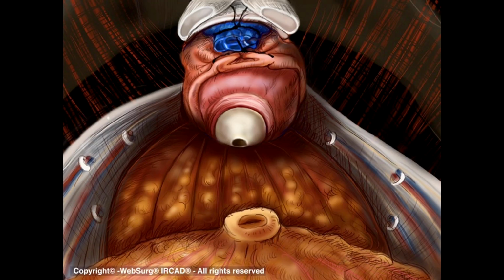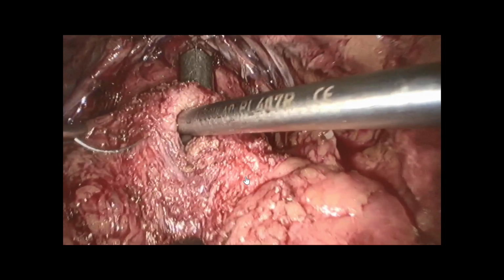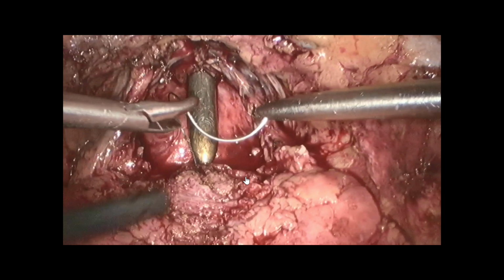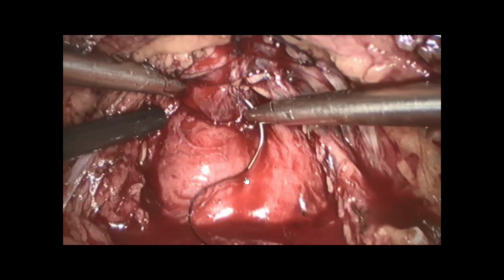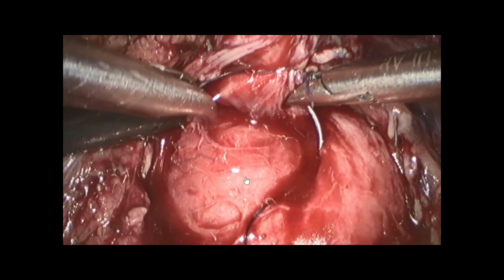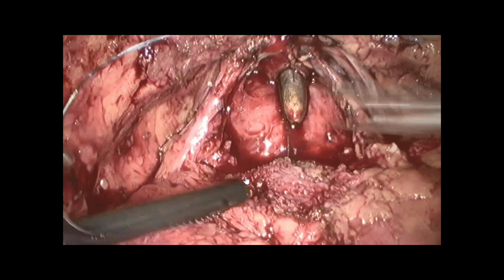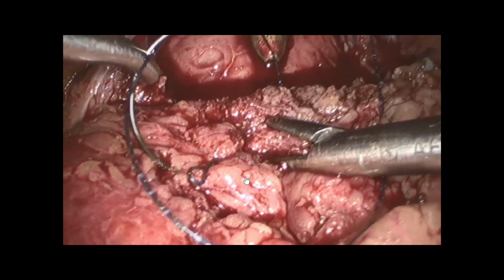Okay. So we are here now, and now what is the anastomosis? The anastomosis, I will do it normally just with a V-Loc. You have seen this morning. Normally, when the bladder neck is well preserved, it's like this. This morning I had to reconstruct, but it's like it's live. And then you see, I will just go, and here what is important is to get just in the urethra and not in the sphincter. So pay attention. Most of the time you see the aspect of the sphincter like a horseshoe. So you pay attention when you get inside.